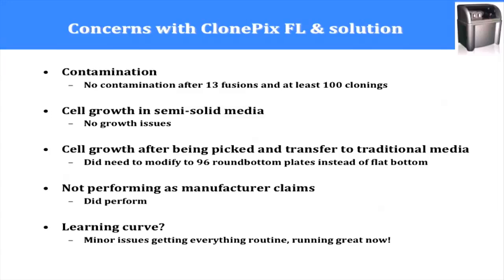The cell grows in the semi-solid media. The cell actually grows much better in semi-solid media than in the liquid media. They actually grow really well. And also the adaptation. After we transfer the cells from the semi-solid media to the liquid media, we're kind of worried about the adaptation. They actually adapt pretty well.